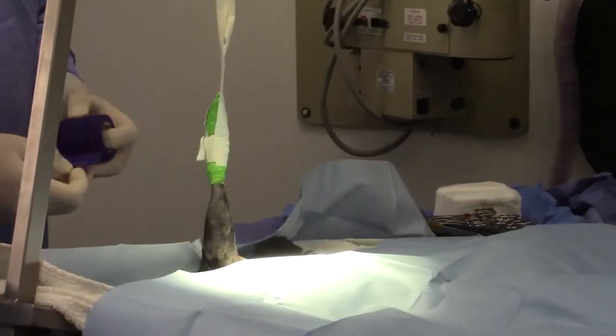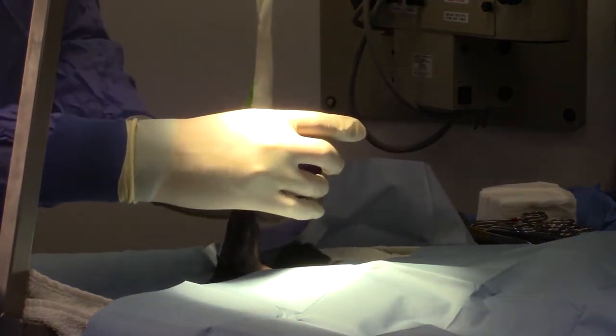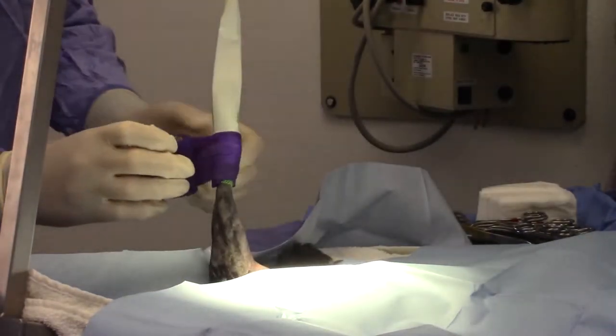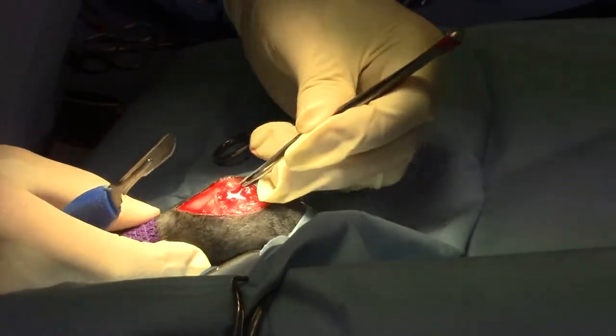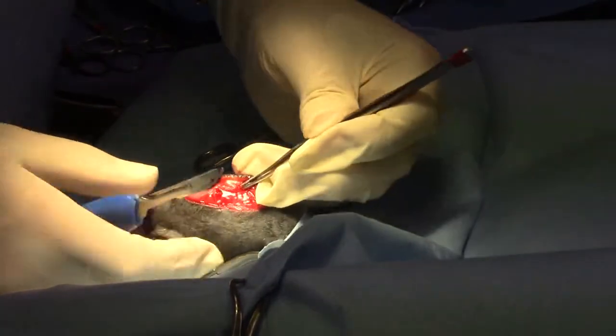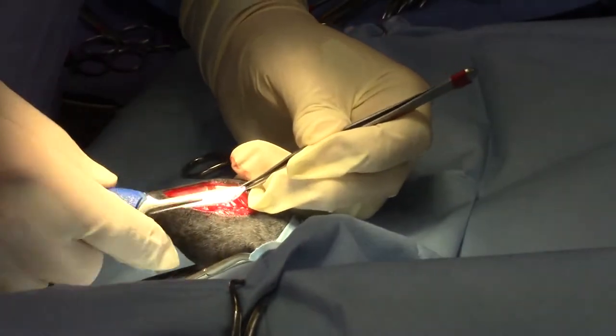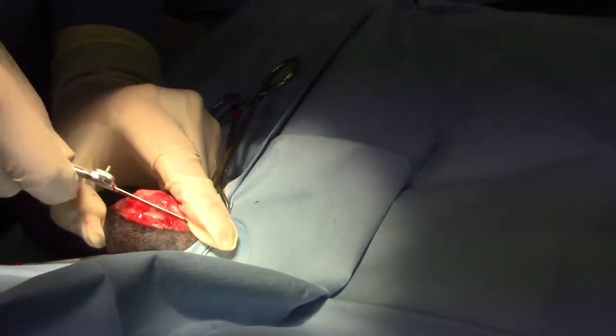The surgical procedures we use to correct this are extremely successful. It is three separate procedures all done on the same leg at the same time. I start by making a lateral incision approach to the stifle joint, and then harvesting a triangular-shaped piece of the fascia lata that we're going to use toward the end of the procedure to imbricate the joint.